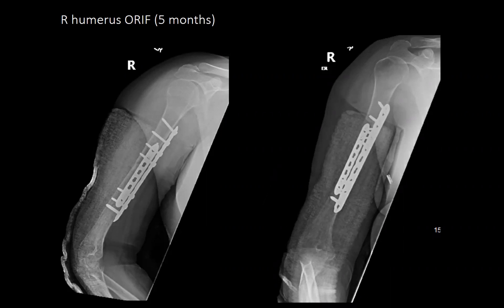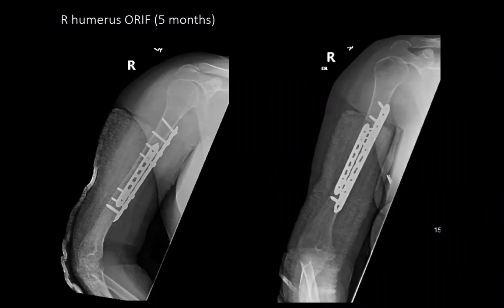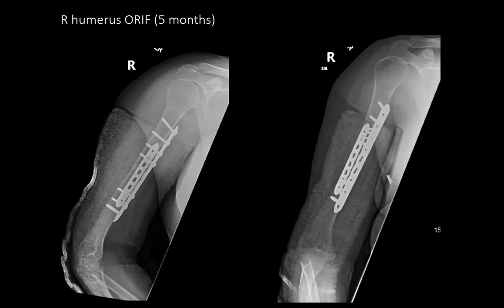What approach did you take? Anterolateral. Did you compress across the fracture site? You did. Can you explain how those two plates work together in compression? So we put the 4-5 plate anterior and got compression at the fracture site, but there's still some micro motion. So we added that 3-5 plate laterally just to add stability. I don't think there was micro motion after that 4-5 plate, just that some of her distal screws in that 4-5 plate, her bone was not great and did not feel like the best purchase with those screws. So, to be safe, I put another plate on it. Still loaded it in compression, but I'm not sure it got us any added compression.